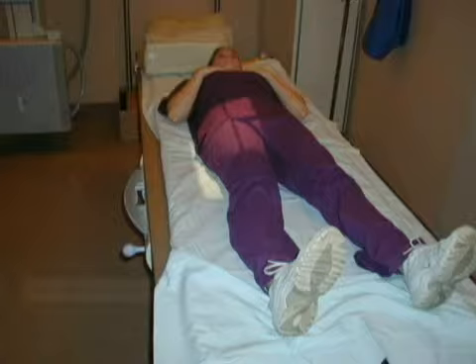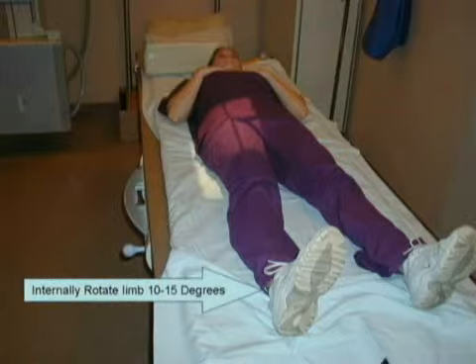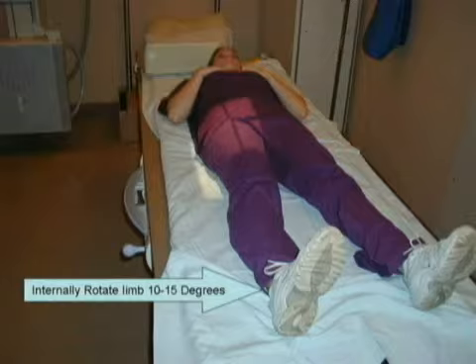Rotate the limb internally 10 to 15 degrees. Direct the central ray perpendicular to the mid femur and center of the image receptor.